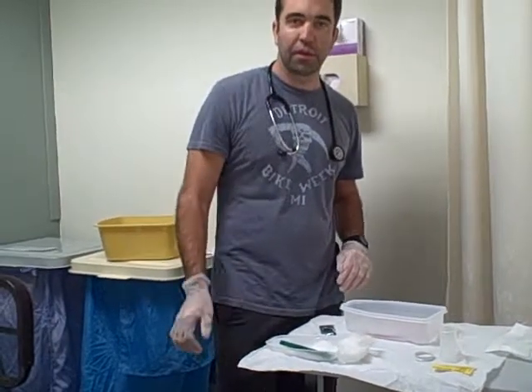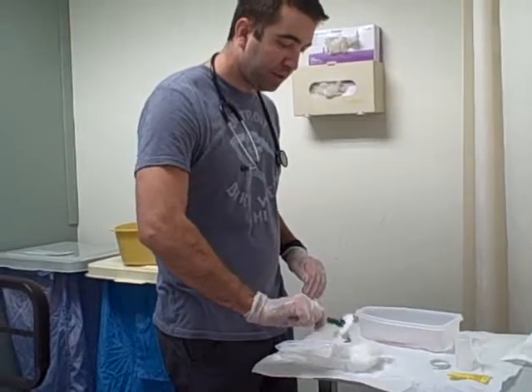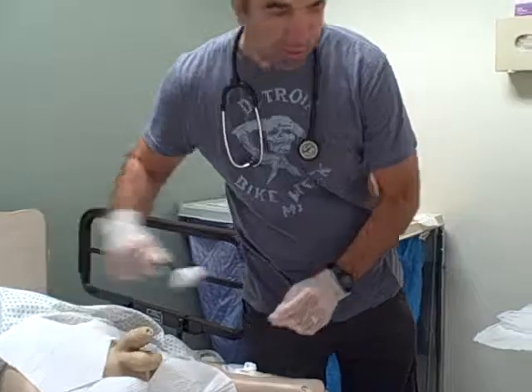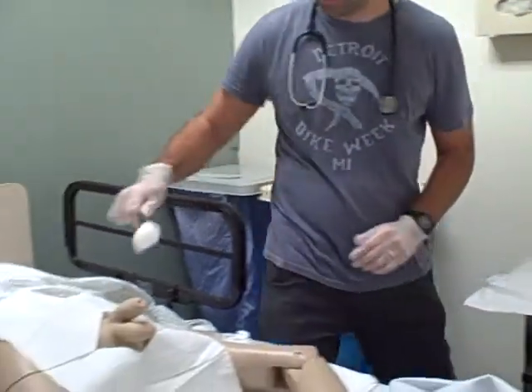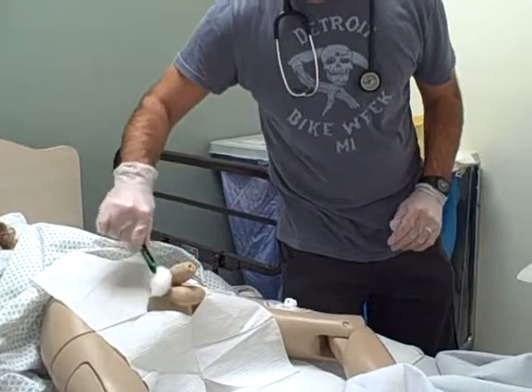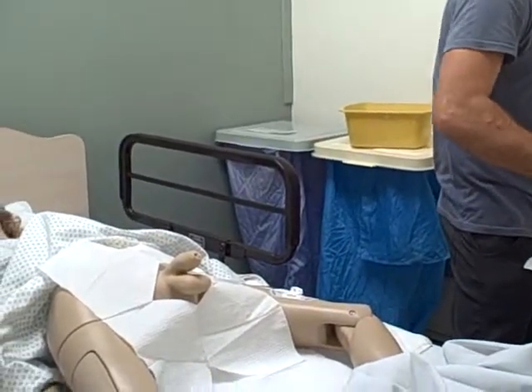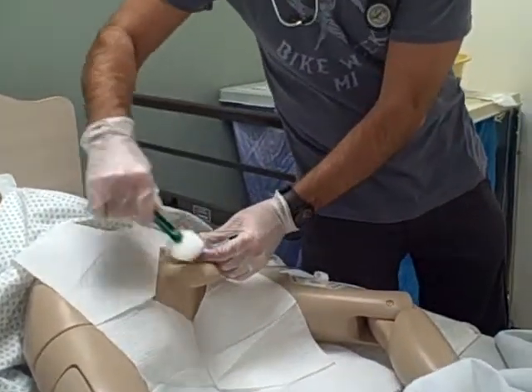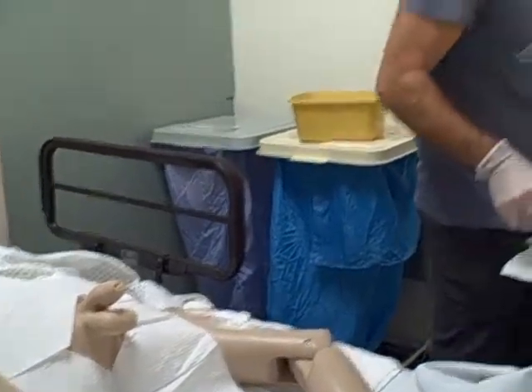clean up the penis. So I'm going to use one cotton gauze pad, clean around, throw it in the garbage, take my second one, clean around the penis again, garbage, and then I've got my last one. Penis, make sure everything is clean, and then throw that away.